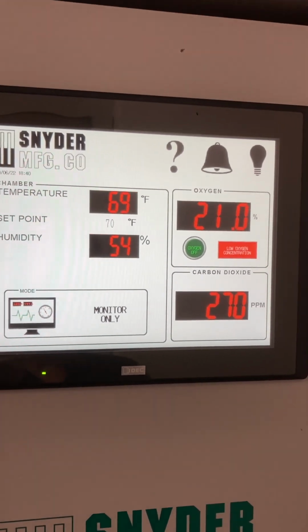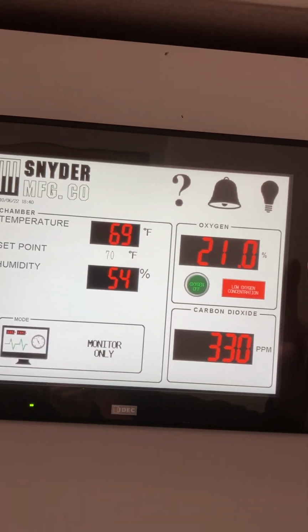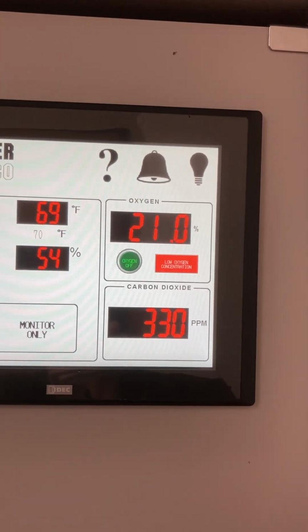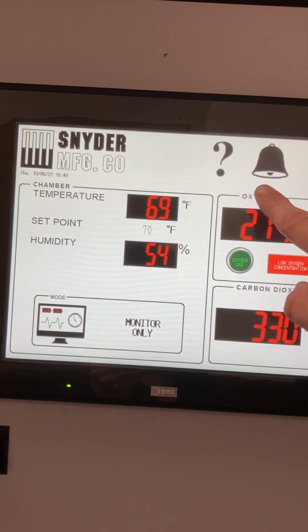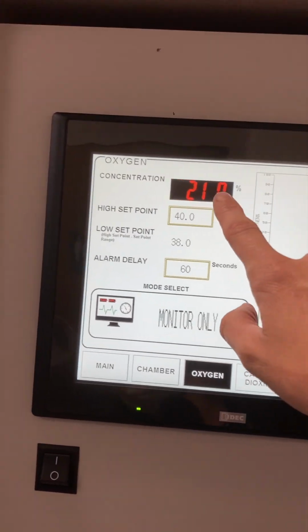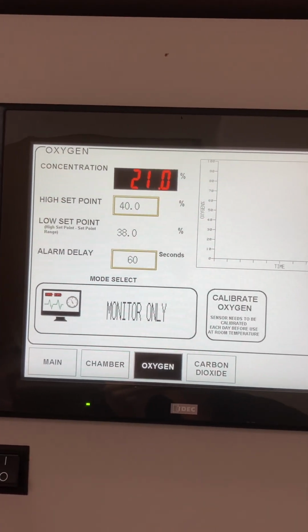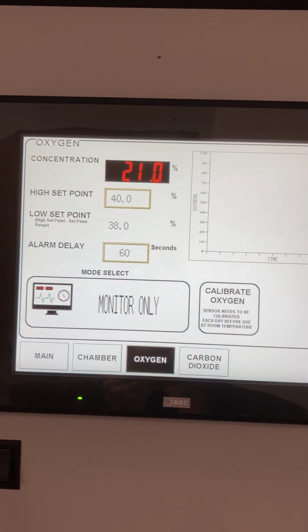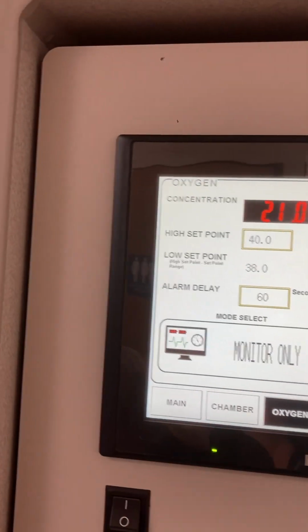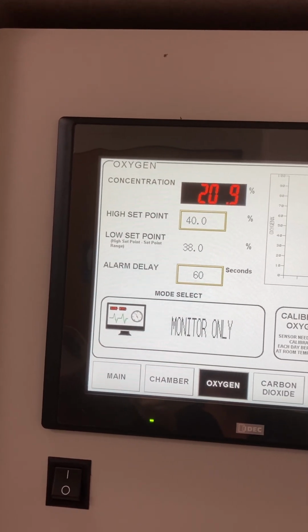Okay, so basic control panels. This is the chamber where the patient sits. This is your oxygen settings, and then this is your CO2 monitor. First thing you need to do before any time you put a patient in is go into the oxygen by touching the word oxygen. You need to wait until this concentration has reached a level point. It appears to be level at 21%, and then you need to calibrate. So you touch calibrate, it's gonna pop up a warning, go ahead and hit okay. And then it'll recalibrate to 20.9, which is room air.